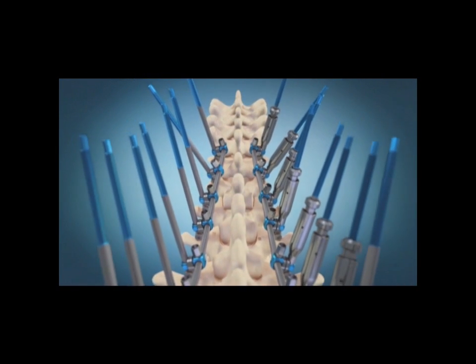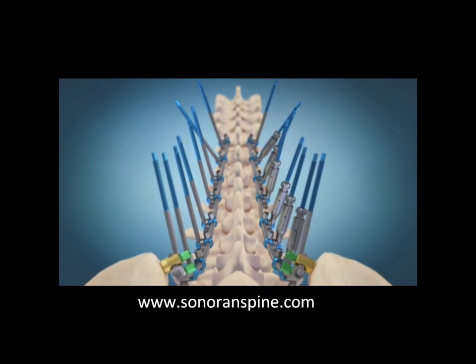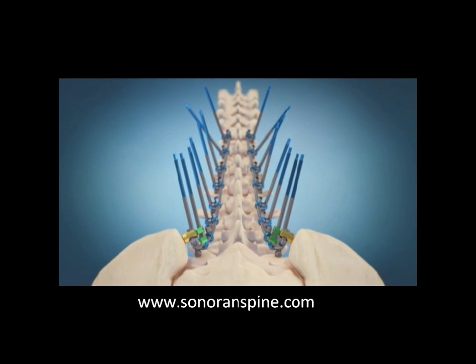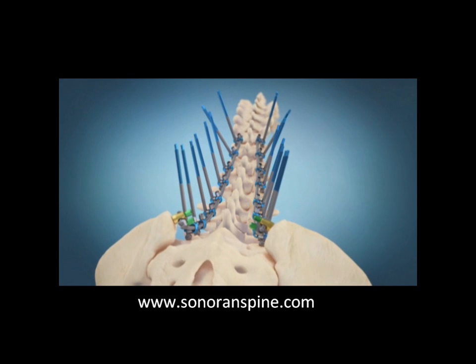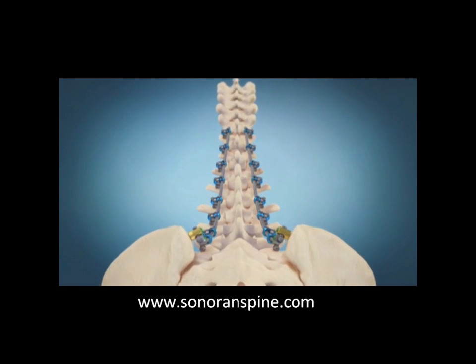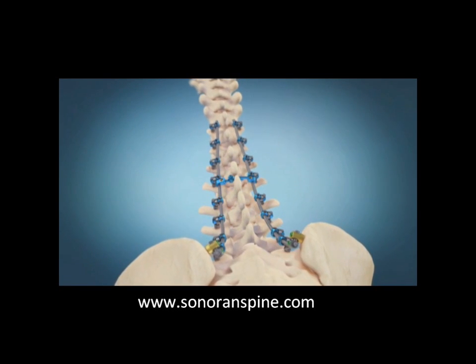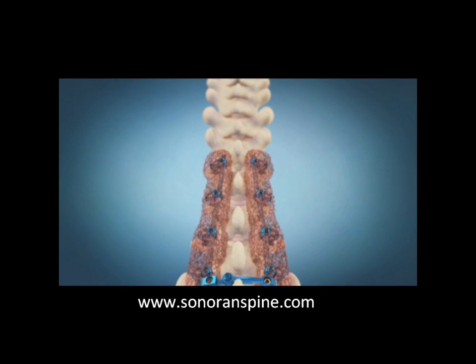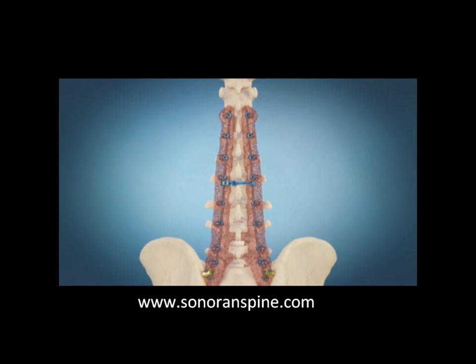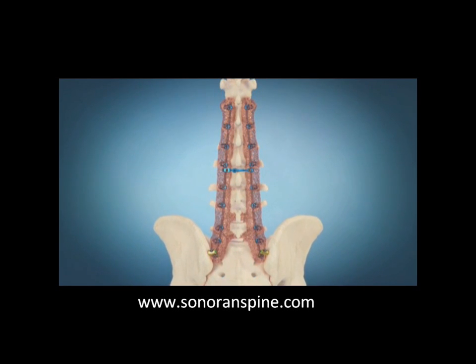Once the rods are placed, the set screws are tightened, locking the posts onto the rod. The rod crimps can then be removed, and the posts themselves can be removed. A cross linkage can be placed in between the two rods, effectively locking all points of fixation together and spreading the stress. Bone graft is applied, which will fuse the spine in this new straightened posture, and that's how degenerative scoliosis is corrected.